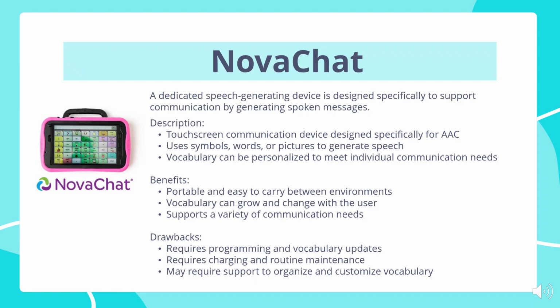Like many dedicated speech-generating devices, the Nova Chat requires regular programming, vocabulary updates, charging, and routine maintenance. Users and communication partners may also need support in organizing and customizing the vocabulary over time.